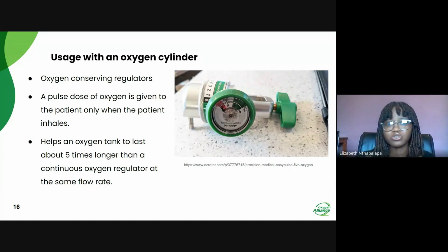So I mentioned that we can choose to give the patient oxygen at the level of 3:1 or 6:1, meaning for every 1 liter of oxygen that we are giving to the patient, if we have set it at 3:1, then we'll be able to give them 333 milliliters.